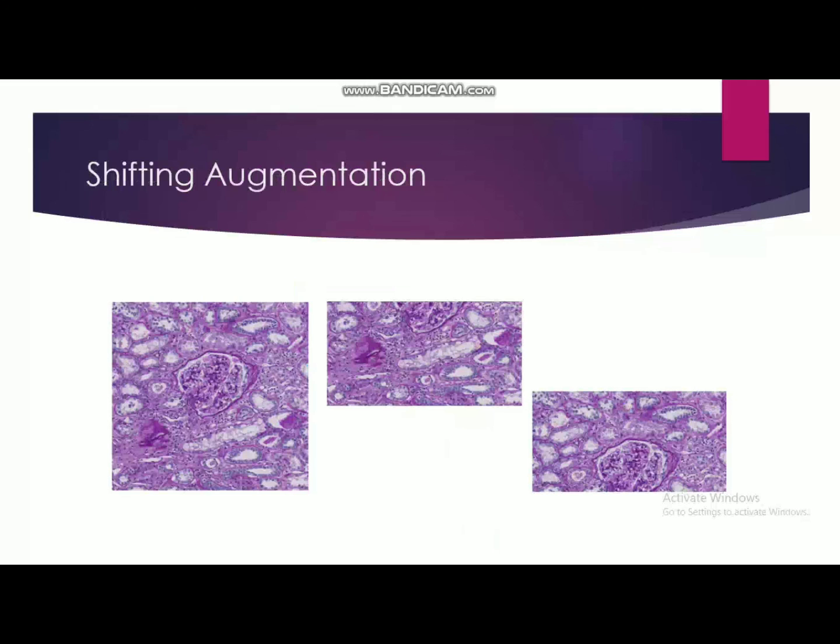Along with some basic augmentations like rotating, scaling, etc., we also did a very simple custom augmentation where we shifted the tiles by half of their size, and this additionally generated data proved to be useful for the model. So the model, instead of memorizing the glomeruli in the center, will consider finding them in other locations as well, and as they are shifted by half the size of the image, the masks might also be shifted or maybe half preserved, enabling our model to learn a robust representation of those masks.